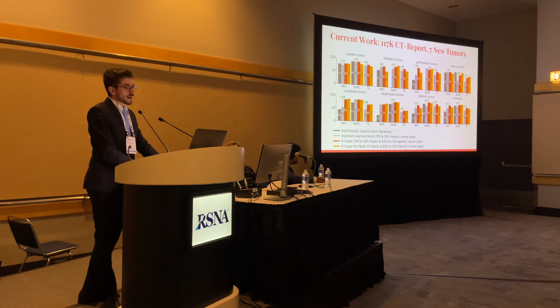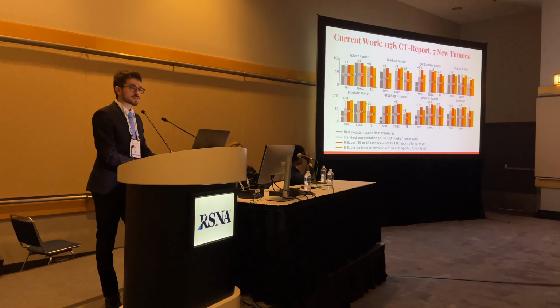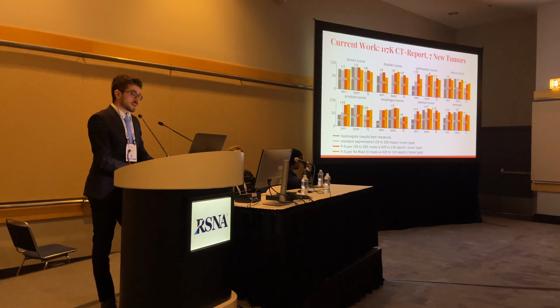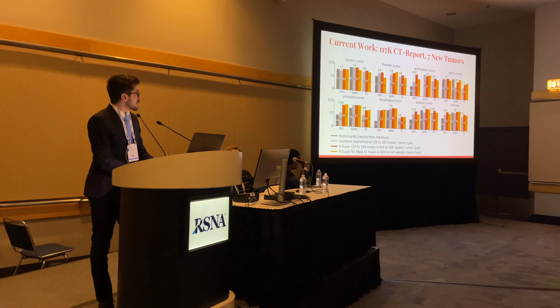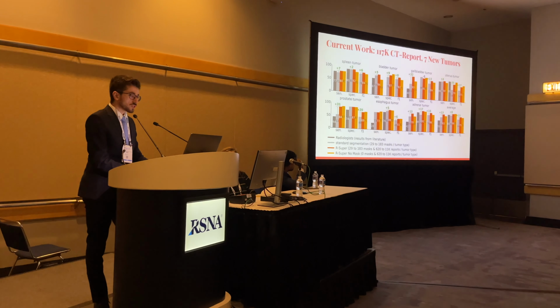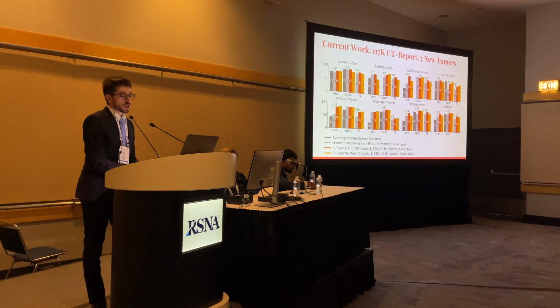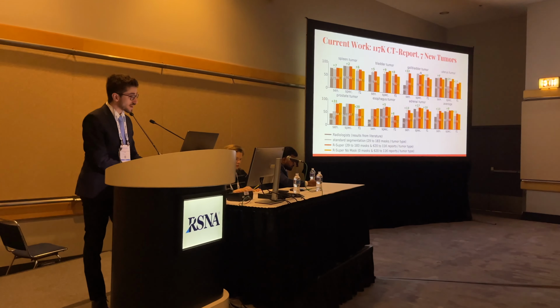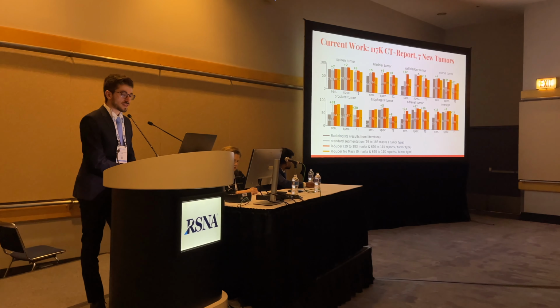So right now we have assembled a very large data set, 117,000 CT scans and reports. And most importantly, this data set focuses on 7 tumor types that you cannot find in public tumor segmentation data sets. So we asked radiologists to create some masks for this data set, about 30 to 200 masks per tumor type. And what we show here is if you train only with the masks, you get the results in gray.